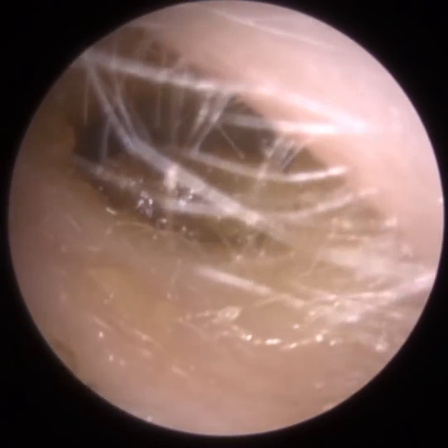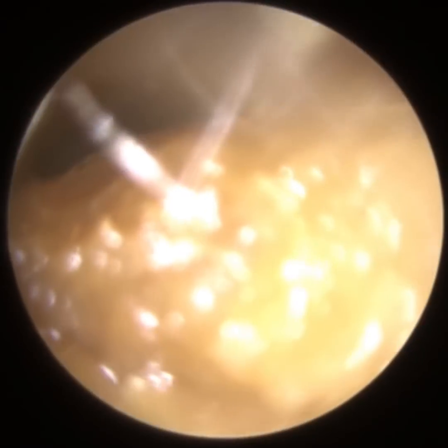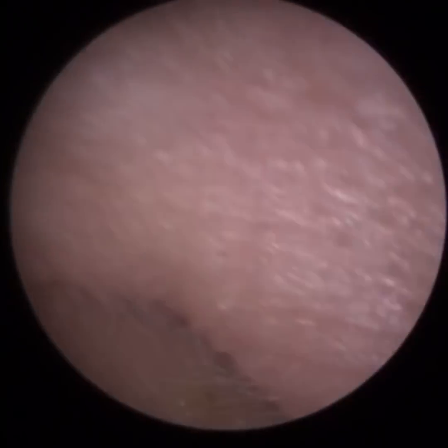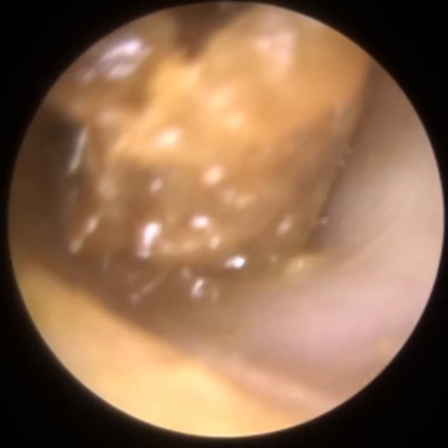The patient's ear canals, and this is both sides, but at the moment on the left, it's completely collapsed at the entrance. So when you've got a collapsed ear canal at the entrance, the ear canal's shut. So how do we get two instruments into the ear? And this is what I teach all our clear wax delegates. So what I'm doing is I'm stretching the ear open, elevating the pinna.